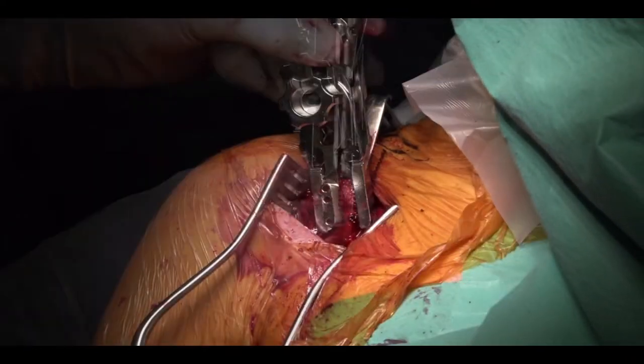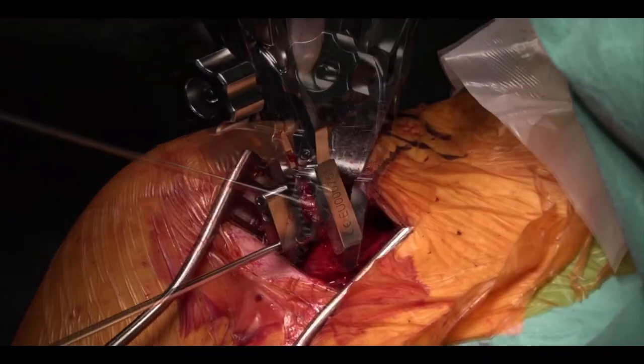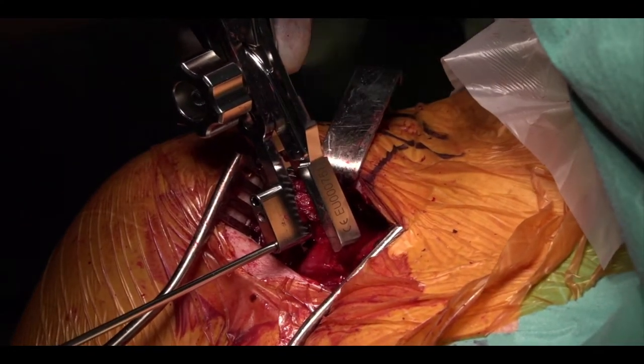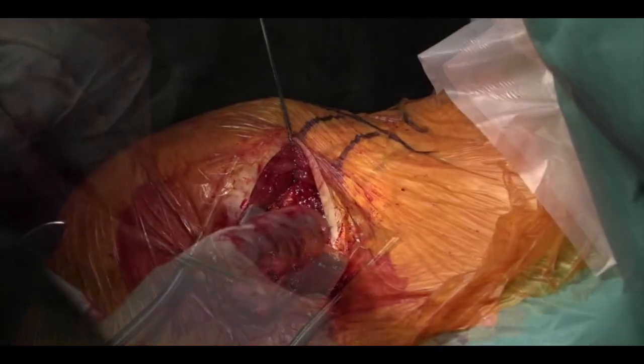The coracoid is then held in the jig and the arm is spun round to choose the desired position. Two 2.8mm drill holes are then made 1cm apart. For this smaller patient the drill holes are nicely contained within the coracoid bone stock.